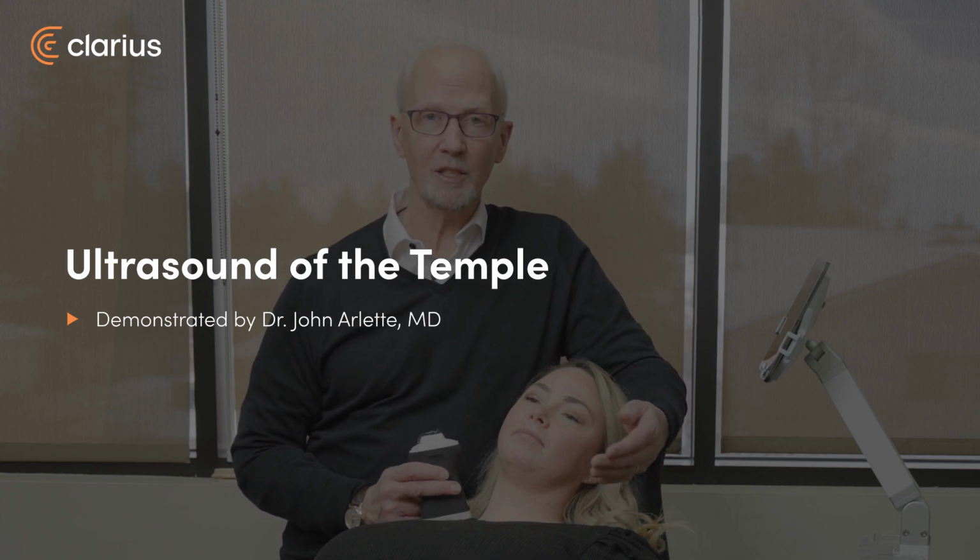In this section, we're going to talk about visualizing the temple. The temple is an important structure for us to be working on to fill with filler. And it's an important structure because it has so many layers. Depending on how you choose to inject, it's important to know what is beneath your cannula or your needle, whether you're over vessels, which fascia you're going through, as well as how deep it is and the muscle.